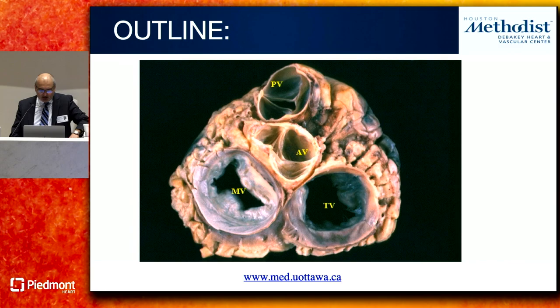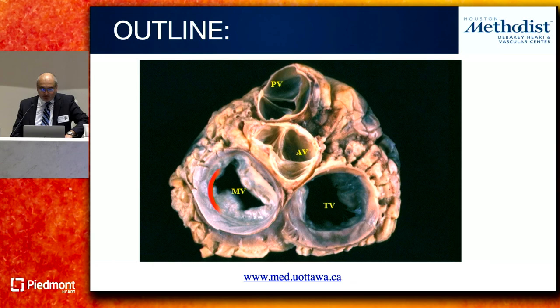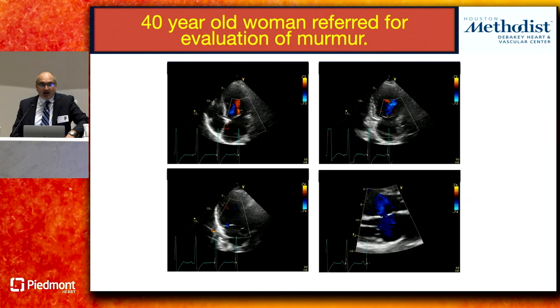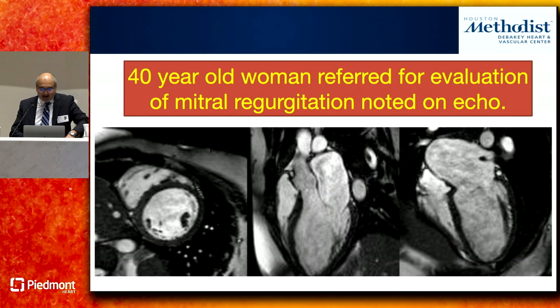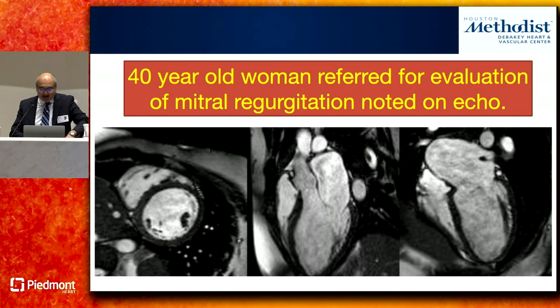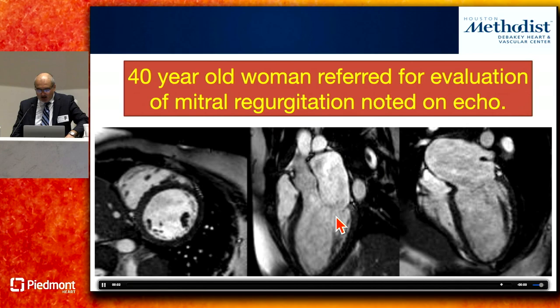Let's start with the mitral valve — probably the most common valve disease we encounter. Going back to the patient with a very eccentric posteriorly directed jet of mitral regurgitation, here's what standard cine images by CMR look like. On short axis, three-chamber, and four-chamber views, we can see a signal void posteriorly with a very eccentric directed jet.